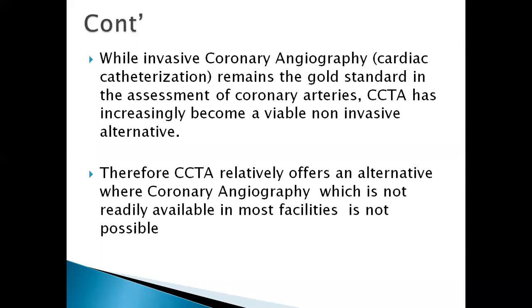I must mention, however, that CCTA is not the gold standard right now with the current literature. It's not the gold standard to evaluate coronary arteries. The invasive coronary angiography, or if you would like to say cardiac catheterization, still remains the gold standard in the assessment of coronary arteries. But we know that CT scans are more available. And also because CCTA is not invasive, it does not involve catheterization, CCTA now becomes a better alternative for patients who cannot tolerate catheterization.